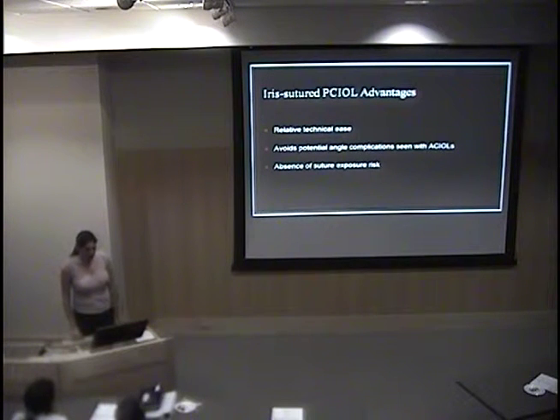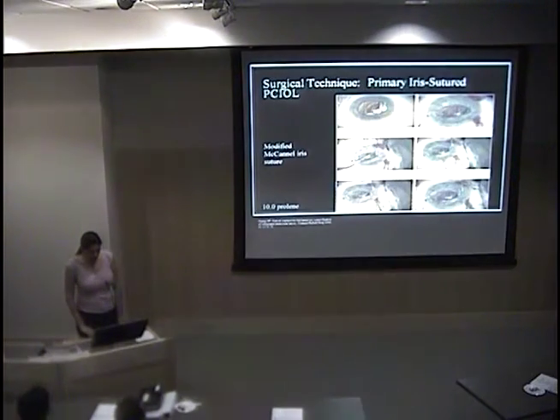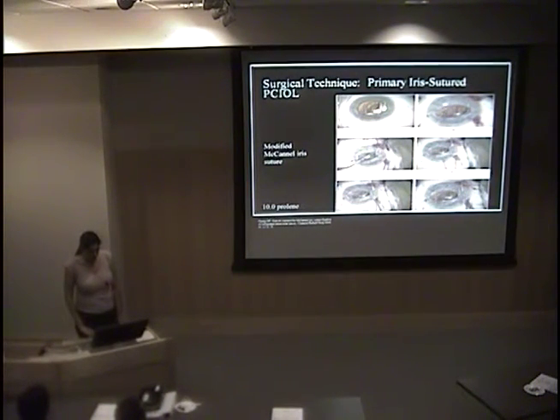So iris sutured lenses have advantages. They are pretty easy to do once you know how to do them, and they avoid potential angle complications seen with ACIOLs, and there's the absence of suture exposure risk seen with the scleral sutured lenses. They also have disadvantages: pigment dispersion, inflammation, hyphemas, CME. I do have a video, but I wanted to point out a few things.